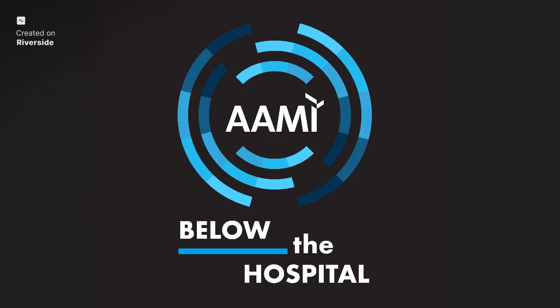So who produces? Instruction for use, or IFUs, are produced by medical device manufacturers as part of the regulatory requirement. Regulatory requirements make sure that they ensure safe and effective use of the products. These documents typically provide detailed instructions for handling, operating, cleaning, sterilizing, storing, and maintaining medical devices used in healthcare settings. The FDA's Quality System Regulation, QSR, specifically requires manufacturers to establish and maintain procedures for device design, production, installation, and servicing, which includes also providing the IFUs to the end user.